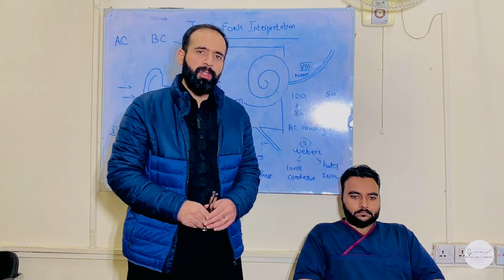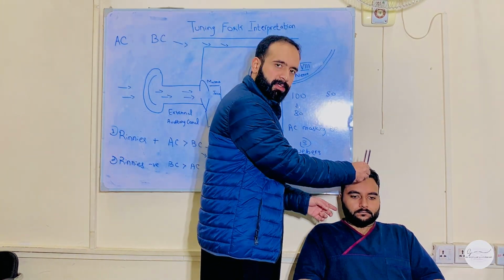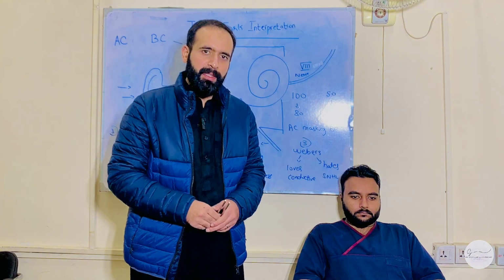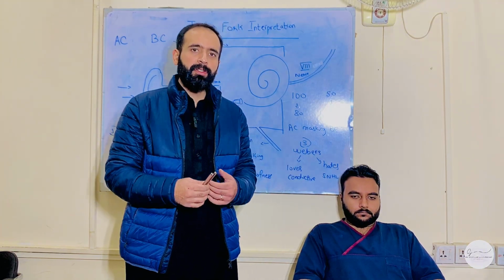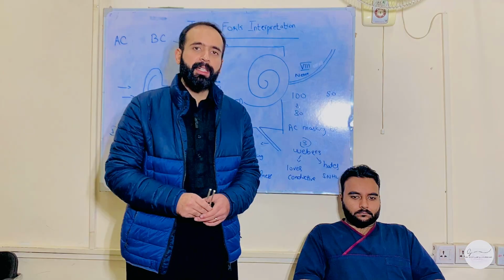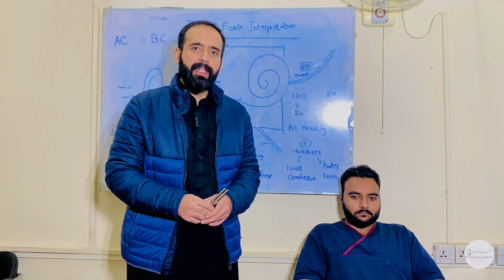But in this patient, when I do the Webers, rather than going towards the negative side, it goes towards the positive side. Now there is a mishap. Now this should not happen. The rules of tuning fork are being broken. They are not being followed. Whenever the Webers is going towards the positive side rather than the negative side and the rules of tuning fork are not aligning, always suspect a dead ear.